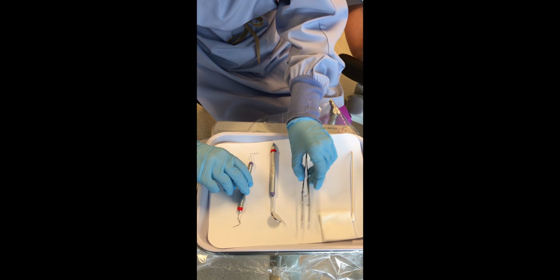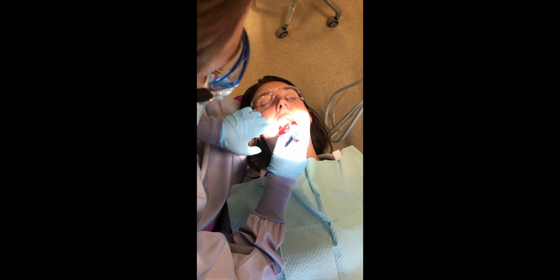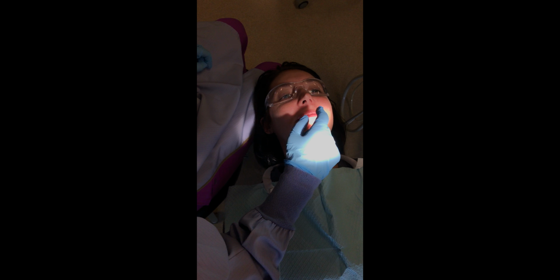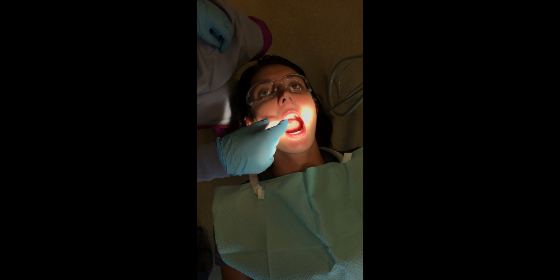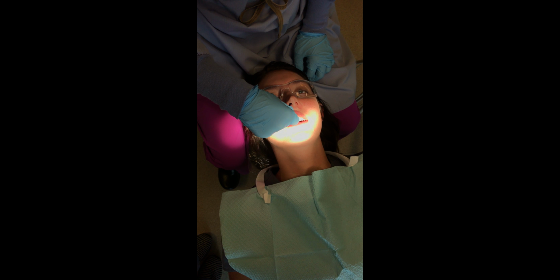Unwrap sterile instruments. Perform initial general inspection intraorally with mouth mirror prior to sequencing. Begin examination with the lips. Visually check the vermilion border. Use bidigital palpation to feel the circumference of upper and lower lips with a rolling motion, and gently stretch lips away from teeth to examine the labial mucosa.